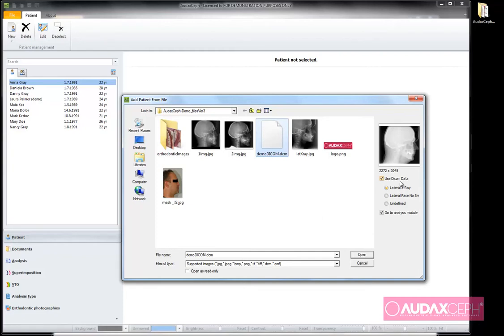the system will automatically read the name, date of birth and gender of the patient. I can also define an image type. It is lateral x-ray.